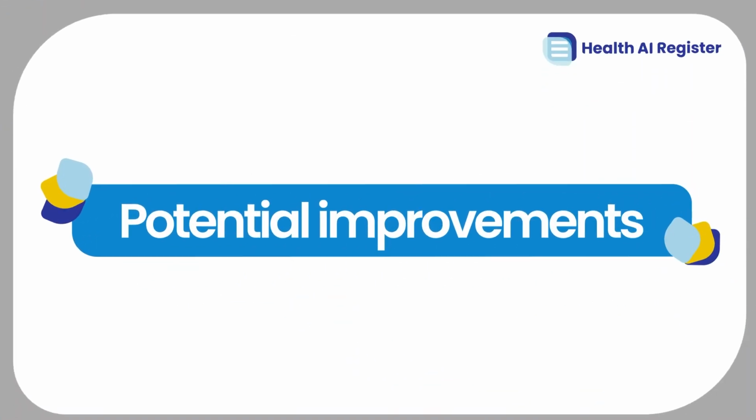If you could give them any advice, Radiobotics, what should they improve in that product? They do need to look at the lateral hip to see if there's anything they can do there. Every radiology department also needs to look at what they can do in terms of improving radiographic practice, exposures, making sure patients are appropriately dressed before arriving in the radiology department.